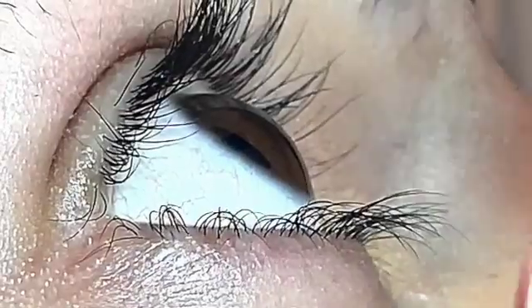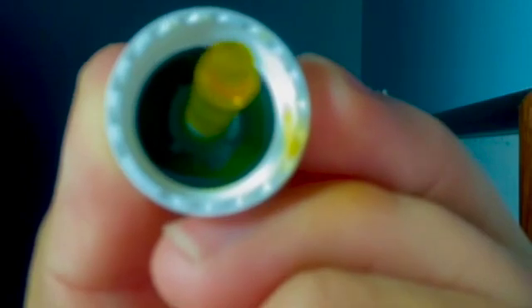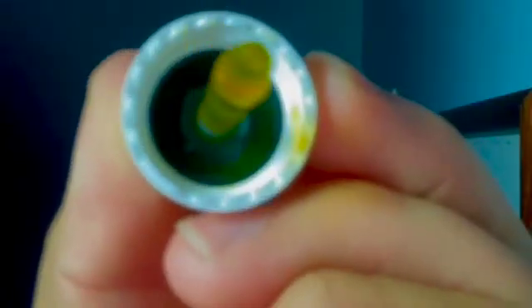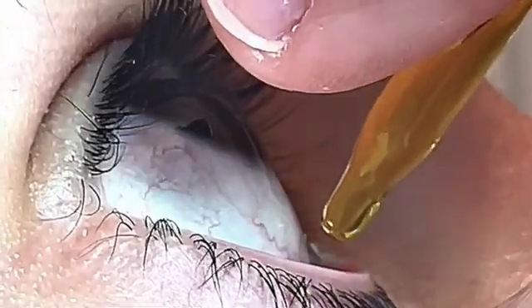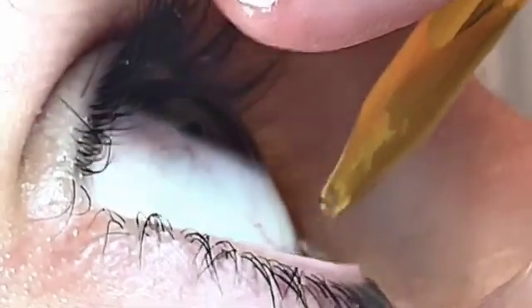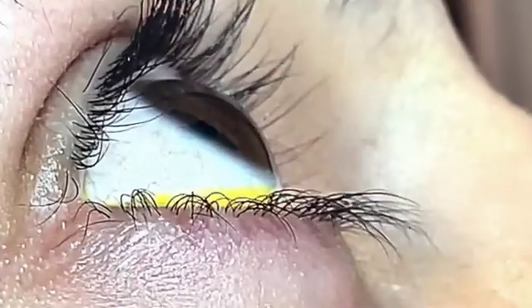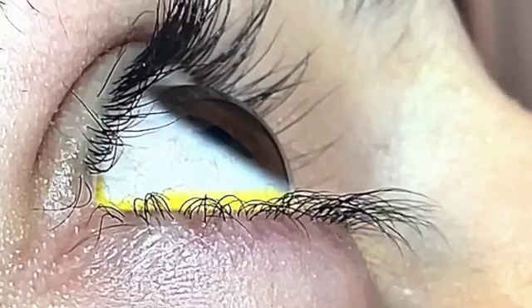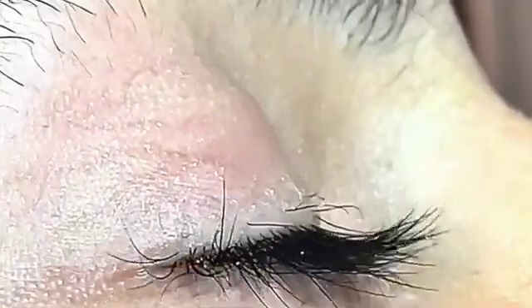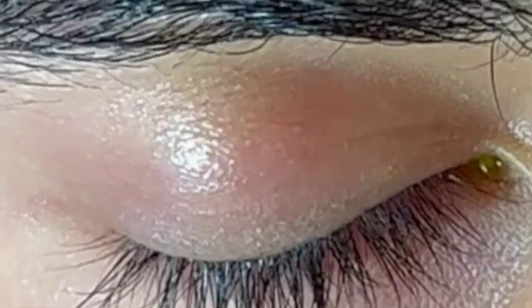Now on to the actual procedure. First, you need an eye drop of the anesthetic to prepare the eye prior to the surgical procedure. This is demonstrated with the point of view. You'll typically get an average eye drop placed right on top of the iris and pupil to allow a slow, evenly distributed amount. However, that puts it on the bottom eyelid to allow a quicker release and even easier distribution around the eyeball. Now you have to move your eyeball around to spread the fluid evenly amongst the eyelid.